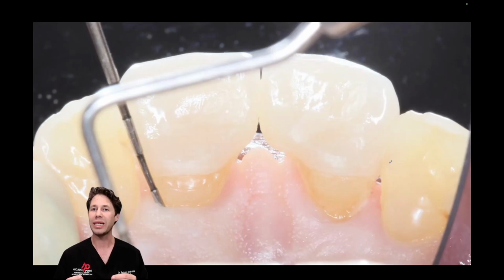We allowed this tooth to heal for 6 months prior to making final restorations. At 6 months, I had reduction in probe depths, but again, when we took our radiographs, we didn't see much in terms of radiographic changes. At 12 months, we started to see some, and at 18 months, we saw a big difference in terms of osseous regeneration from the preoperative radiograph to the 18-month postoperative radiograph following laser assisted regeneration.